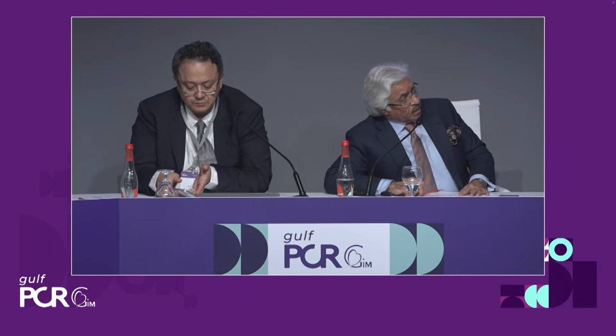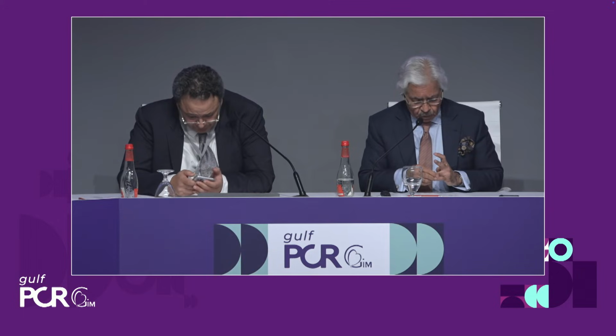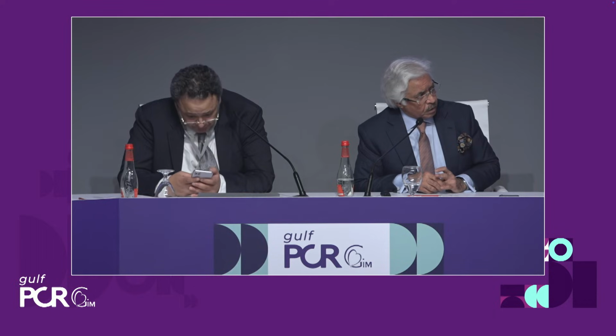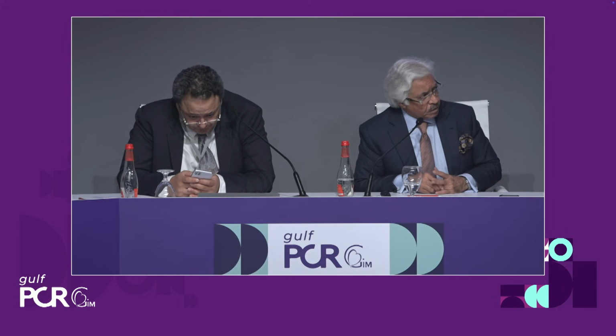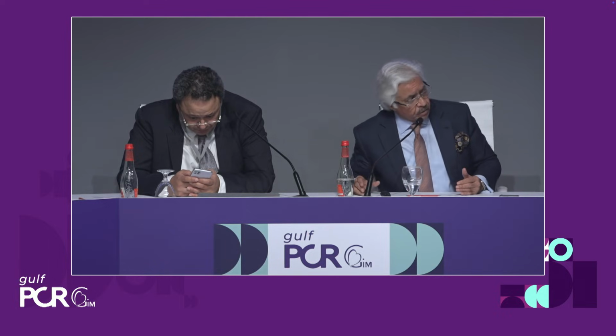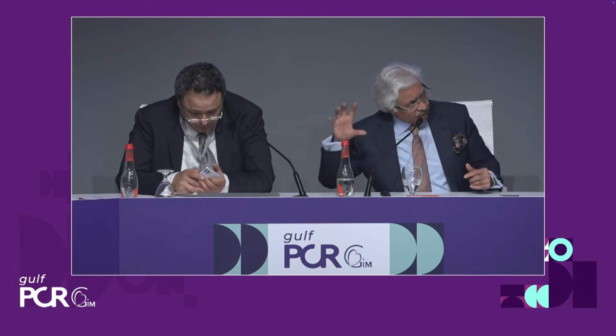Thank you very much. We do have time for a question. My suggestion is, yes, we're putting together all our earlier cases done in 2018-19. Remember, we started it as a first-in-human study in 2017. We're putting our cases together for a long-term follow-up. And I think a 5-year follow-up, which could be multi-center, multi-regional, would be a great collaboration. We agree. Probably there are centers that can come on board also. That's right, and we look forward to that sort of collaboration.